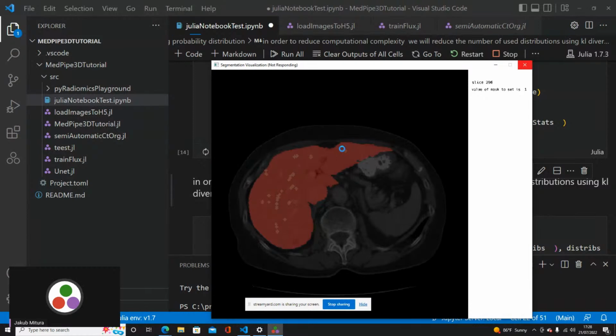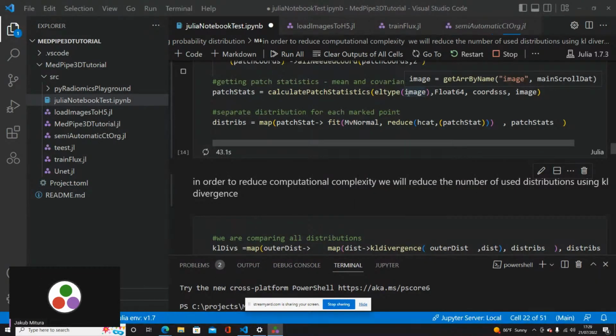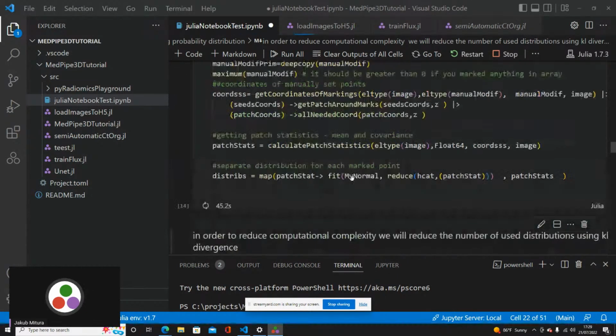However, when you patch any point, you don't patch just one point. You get a lot of points around, about 9 points around. So it's hundreds of points, and getting all of the neighborhoods, all of the standard deviations, all of the means generally starts to be a bit problematic. It's not a huge problem yet, but it starts to be problematic.